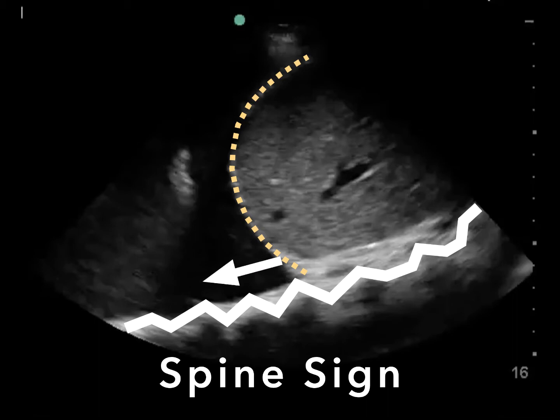We would not expect to see this in normal lung because air-filled lung does not propagate ultrasound waves. In normal lung, the spine should end at the diaphragm. Because we can see the spine sign extending above the diaphragm, we know that it has to be fluid or pleural effusion allowing propagation of our ultrasound waves to the spine.